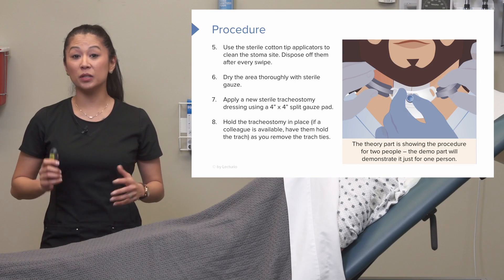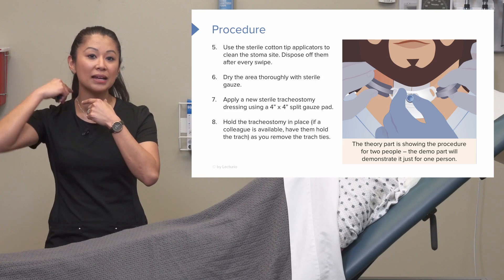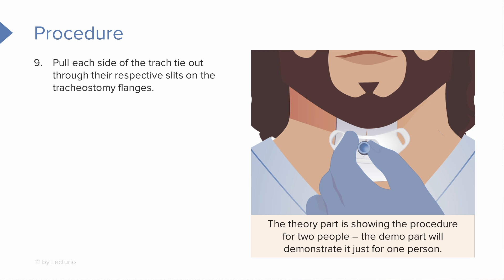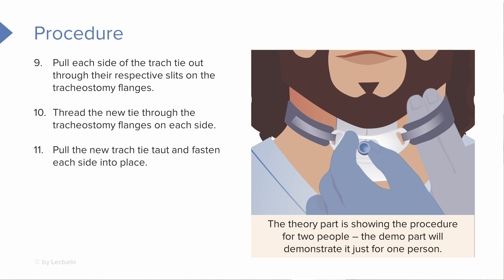If you have some extra hands, have a colleague help hold that trach in place as you remove the tie and the bandages — that's really helpful, so grab a buddy if available. Pull each side of the trach tie out through the little slits on the flanges, then thread the new one through, pull the trach tie taut, and fasten around each side.